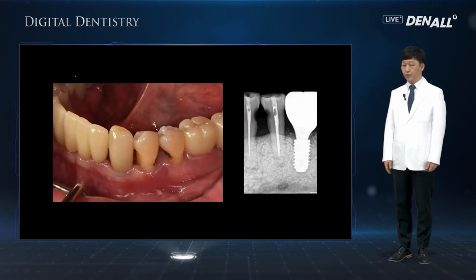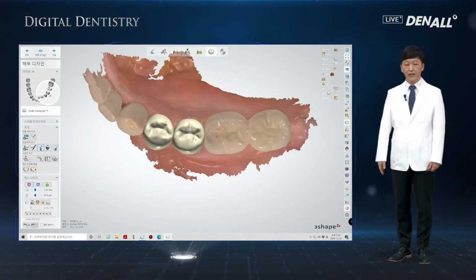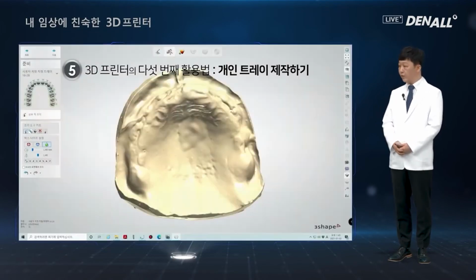In the lower left premolar area, caries is quite severe. And the treatment was done. Likewise, we did the modelless final prosthesis design, and the final prosthesis was completed. At last, it's time to fabricate the final denture for the maxilla.